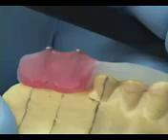So what they will do is take their 2.8 millimeter measuring stick that comes with their surgical drills, and they will make sure that they have relieved the bone in these areas so that the bone is 2.8 millimeters lower than the final gingival margin.